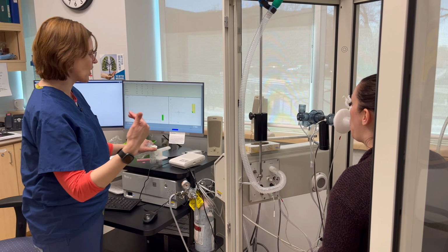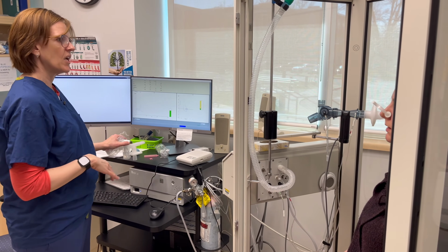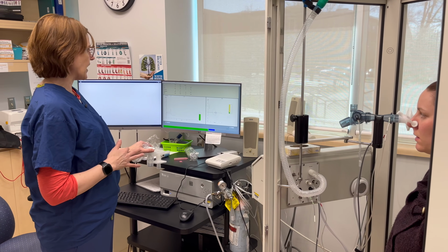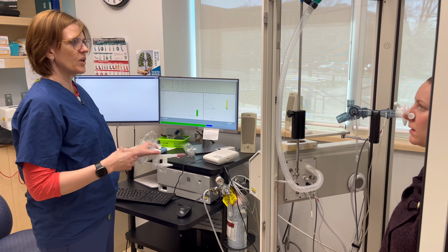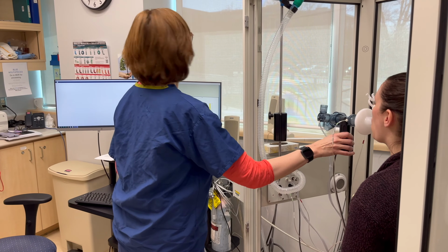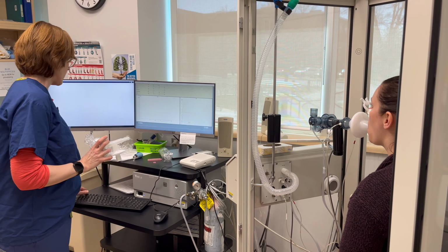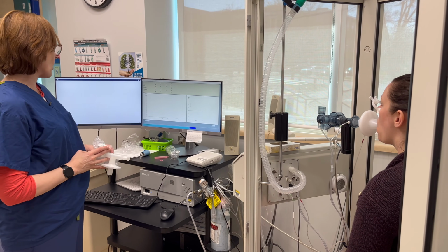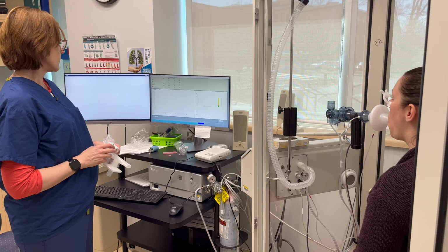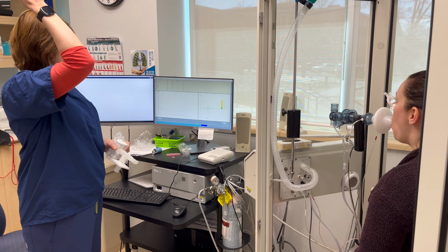There are various doses of methacholine that can possibly be inhaled. The patient breathes in the methacholine for 2 minutes, followed by a fast, hard blow into the mouthpiece, and this will occur twice after each dose. The test will continue once we see that the patient reacts or that all the methacholine doses have been done. At that point, we give the patient puffers to open up their airways, and then we wait 10 minutes, and then we repeat their lung function again to make sure that they're back up to baseline before they leave the lab.